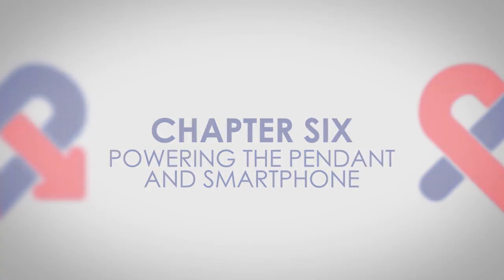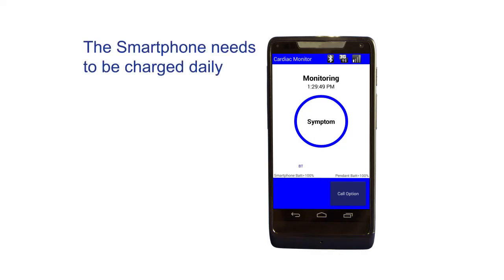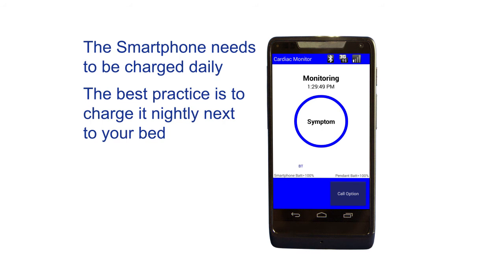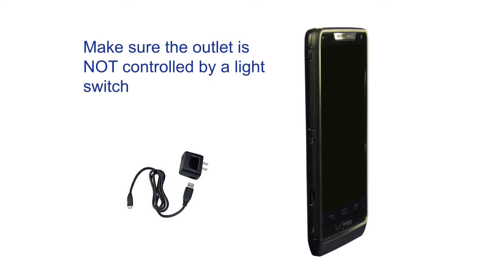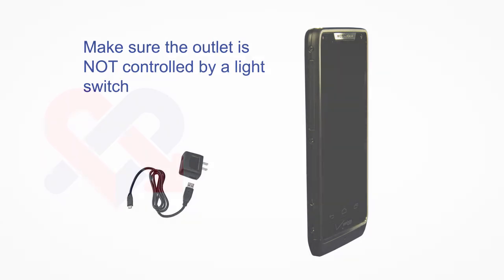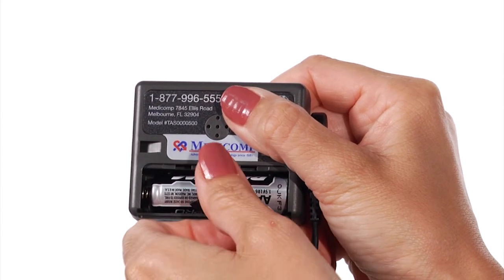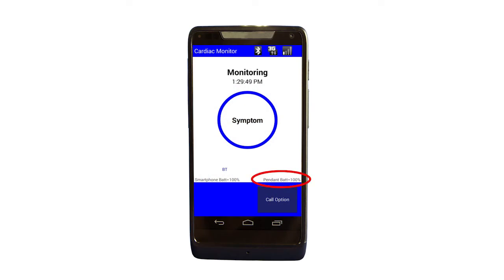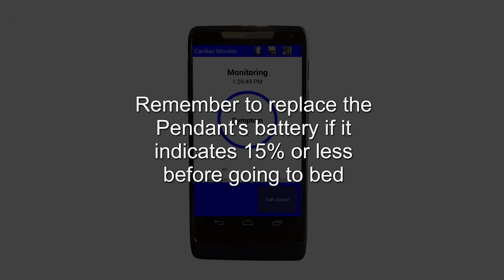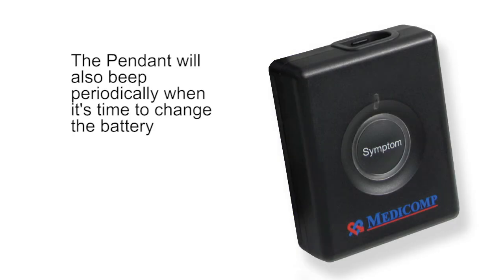Powering the pendant and smartphone. The smartphone needs to be charged at least daily — best practice is to charge it nightly next to your bed. Plug the charger into the smartphone and into a wall outlet, making sure the outlet is not controlled by a light switch. The pendant uses one AA alkaline battery that needs to be replaced periodically. The smartphone will alert you when the pendant's battery needs to be changed. Remember to replace the pendant's battery if it indicates 15% or less before going to bed. The pendant will also beep periodically when it's time to change the battery.